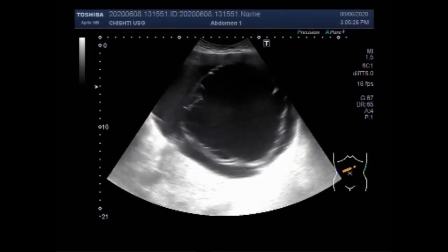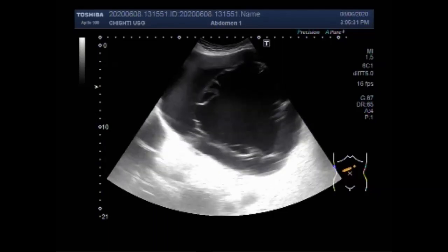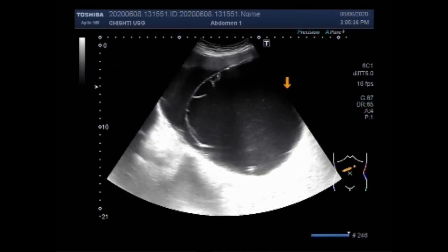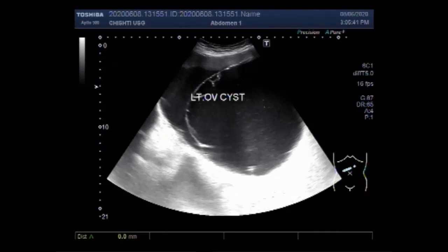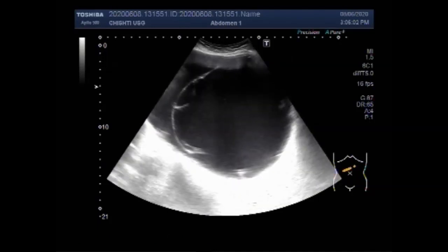Now you can see this cyst is about more than 17 cm in diameter, and you can clearly see the septation. The measurement of this cyst shows it measures approximately 17 cm x 15.6 cm x 17.7 cm x 16 cm — quite a large cyst.